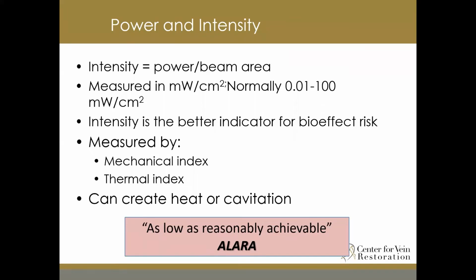Cavitation is known as the mechanical index. It occurs when the sound wave separates the cells as the wave passes through the tissue. For short bursts of time, a little cavity is created. The damage may occur when the cells slam back together after being pushed apart by the sound wave. While intensities that are used in the vascular lab are not likely to create a bioeffect, we still make sure that we utilize the ALARA principle: as low as reasonably achievable is what that stands for.